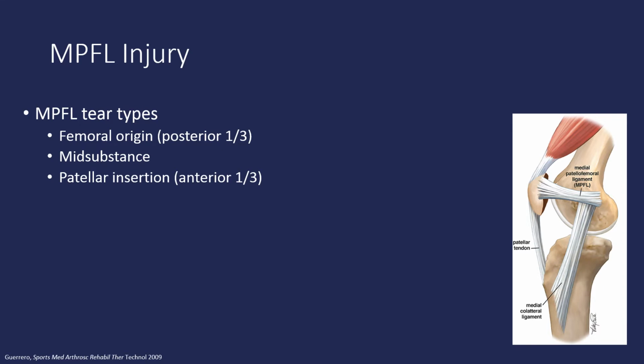MPFL tears can be identified by where specifically the tear occurs. Between 50 and 90% of the injuries to the MPFL involve the patellar insertion. 25% of the time, an avulsion tear of the MPFL at the adductor tubercle occurs.